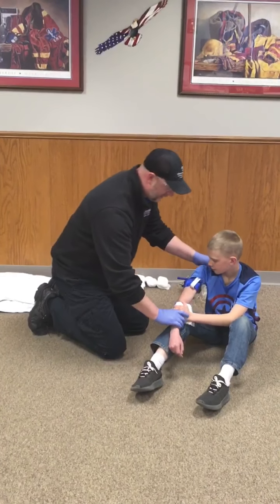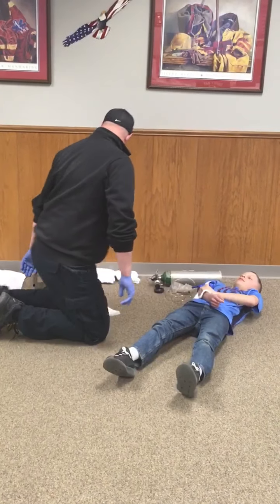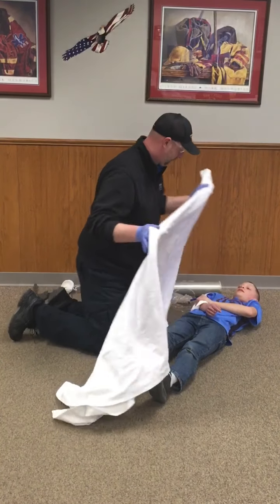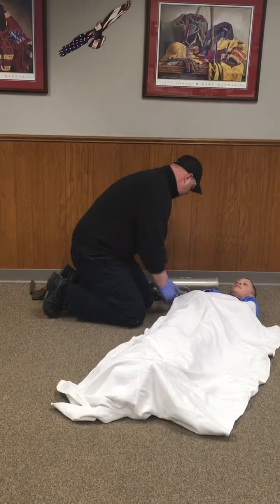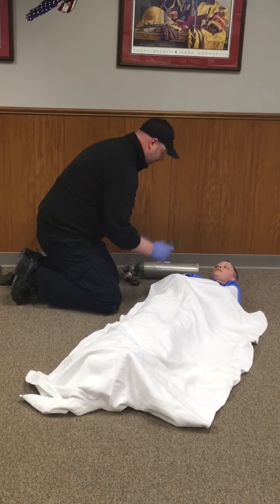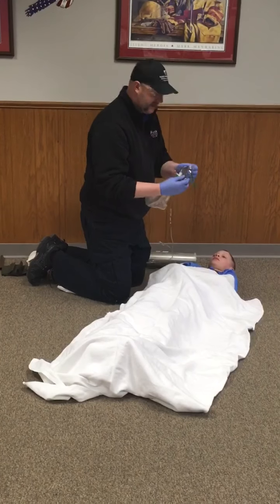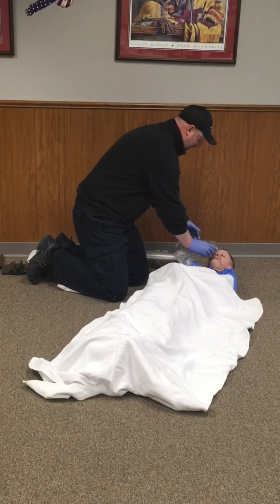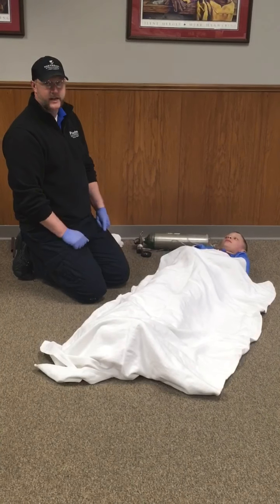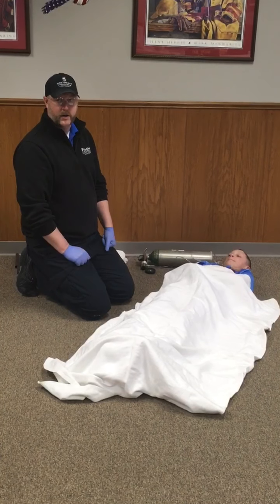To treat for shock, we're going to go ahead and lay our patient down, cover them up to keep them warm, and attach oxygen — placing a non-rebreather mask on the patient. Since I don't have oxygen going, we'll verbalize that the mask is in place and oxygen has been applied. At this point, we immediately transport the patient to the hospital, then let the evaluator know you're done with the skill.